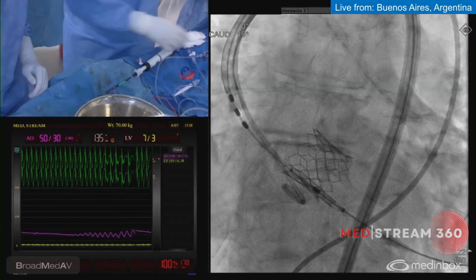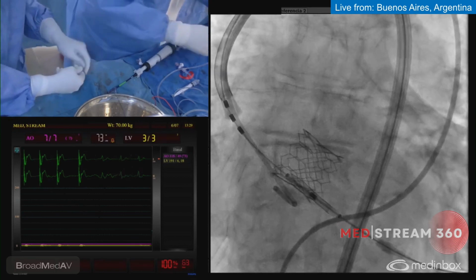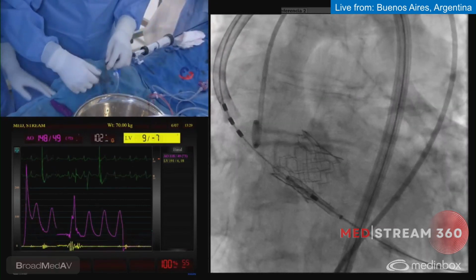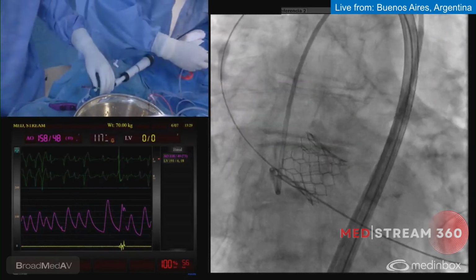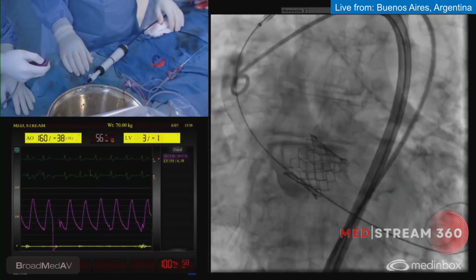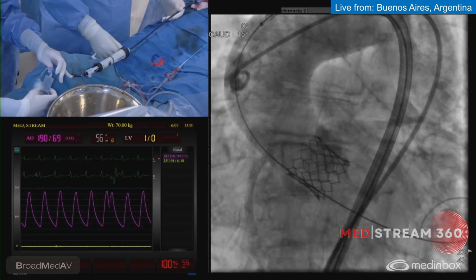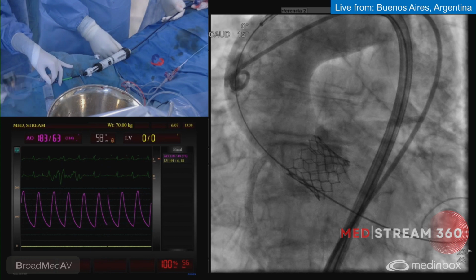Okay. Now give me the Amplatz wire, stop the pacing. We decrease pacing very slowly. She had some bradycardia before. I can do a minimal test before pulling everything out. Let me pull the catheter out very slowly, as I always perform. And let me do an echo here. We have some paravalvular leak, but in my opinion, one extra cc is going to be okay. The oversizing is going to be 12 or something like this. It's not too much, and she has such severe calcification.